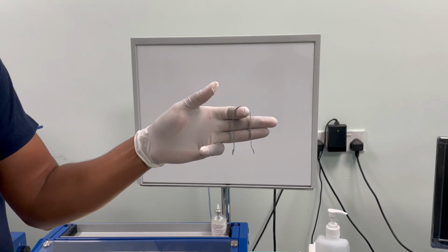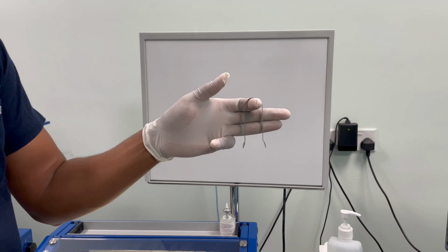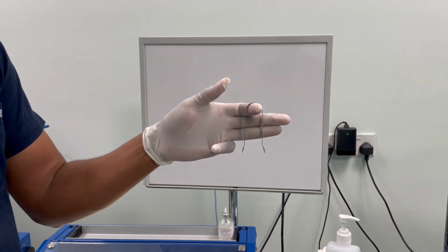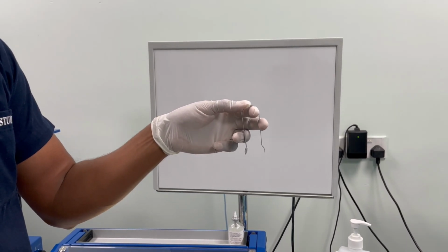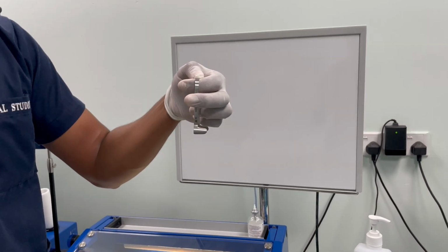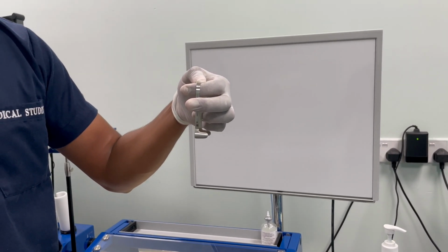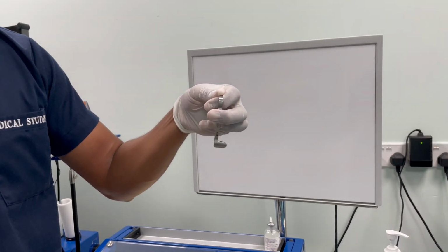In the next part of the examination, we are going to use the Thudichum speculum. We can hold this from your left hand index finger and use the middle finger in the front, ring finger in the back, and use your thumb to firmly grip and support the speculum. Then you twist your hand and direct the pointers towards the patient and use your middle finger and the ring finger to open and close the speculum.